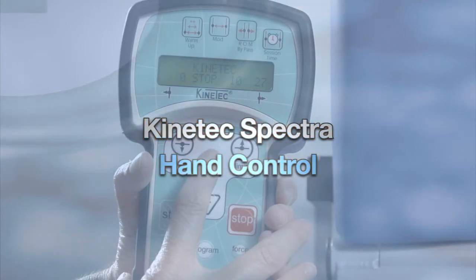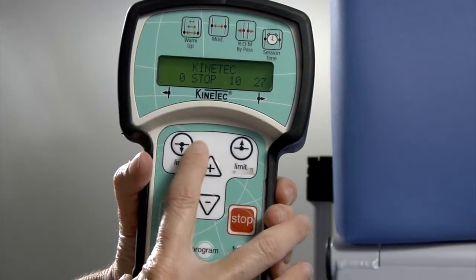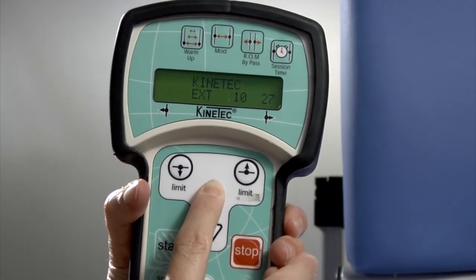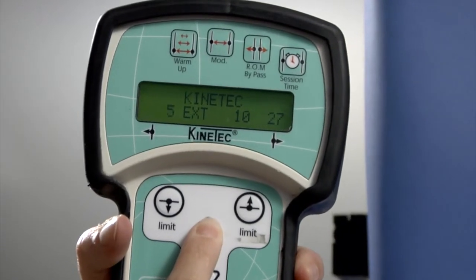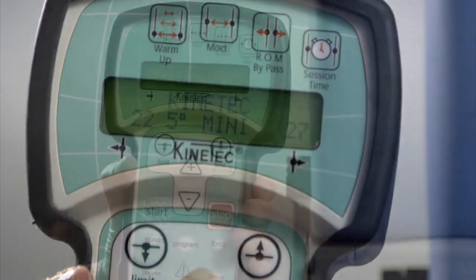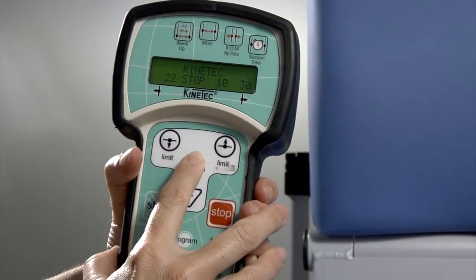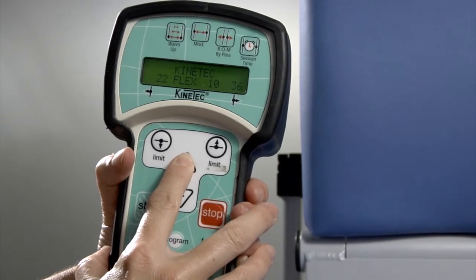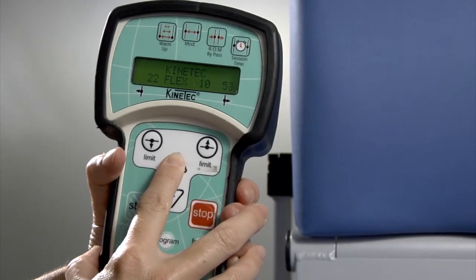The range of motion on the Kinetec Spectra will run from -10 degrees of extension to 120 degrees of flexion. To change the extension to the desired or prescribed limits, push and hold down the extension button while pressing the appropriate arrow. To change the flexion to the desired or prescribed limits, press and hold down the flexion button while pressing the appropriate arrow.